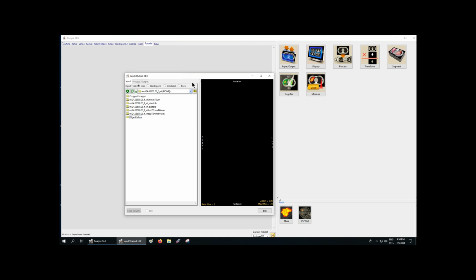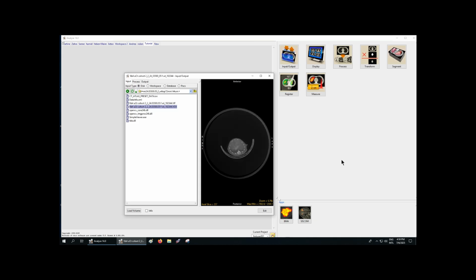The micro CT scans that I'll be using are mainly of the thoracic and the abdominal region of the mouse, since that will be the most relevant regions for aorta extraction. And for this tutorial specifically, I'll be using the 72mm top view. And hereby you'll be wanting to use the VOX file. You'll be greeted with this box, and since there's no specified input, it has no maximum or minimum information for the intensities associated with it, so we'll be pressing on calculate, and then Analyze Direct will be automatically calculating it.